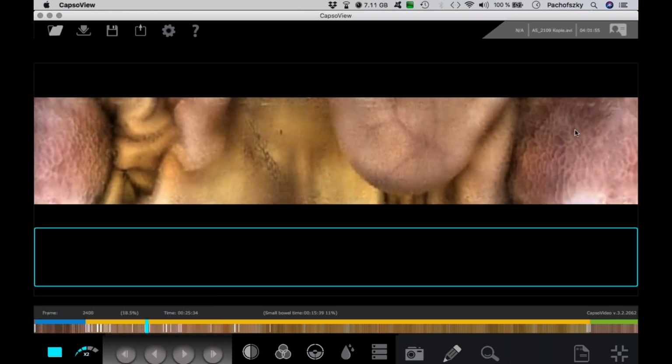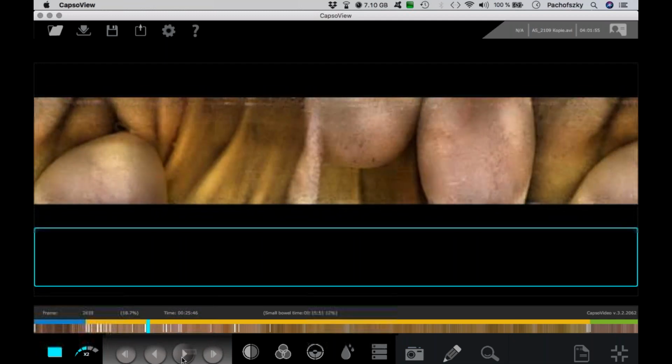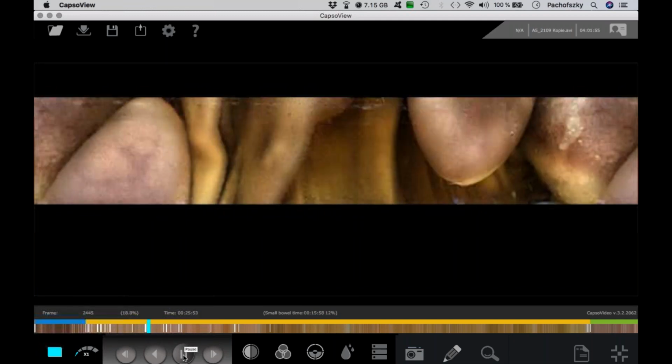If you look at this, again on the right side and the left, we have the same pictures, and that's totally another thing if you compare it with this. We have big fat villi, they have another color. So going on, I think I will reduce my speed so we can see the details better.